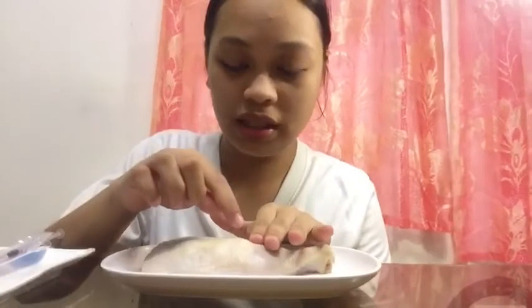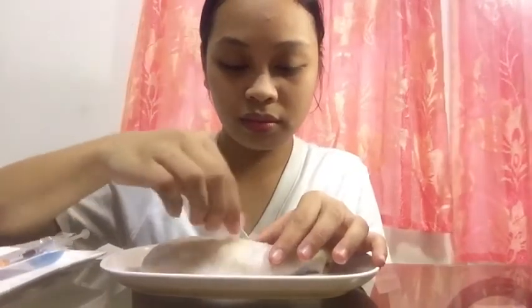for the privacy of the client, and then select and clean the site. So usually the site is 4 fingers below the antecubital. So 1, 2, 3, 4. So this is the area. So I am going to clean it with a cotton ball. And then I'm going to let it dry. And then I'm going to apply clean gloves.